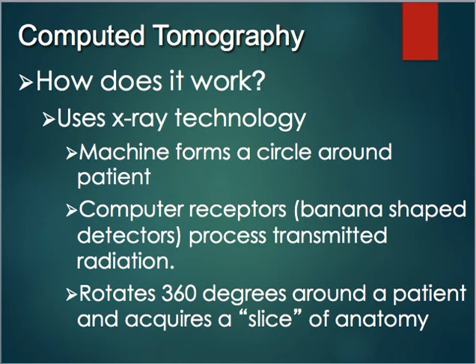So the CT scanner is like a big donut, like I showed you on the image before. The opening or hole inside is called the patient aperture. It's usually about 60 to 70 centimeters in diameter, which isn't really that big.